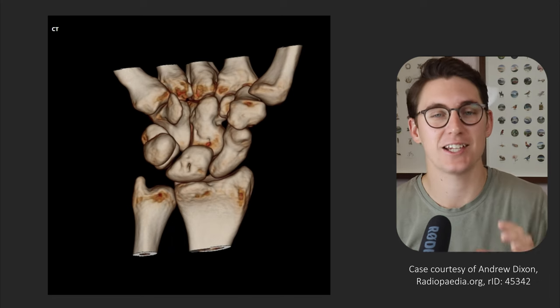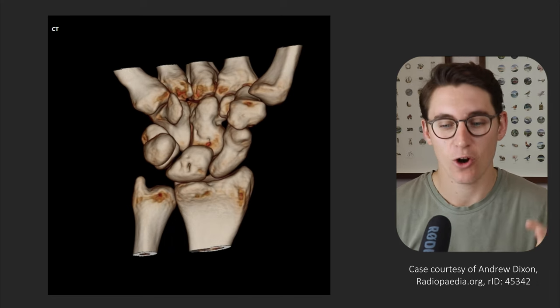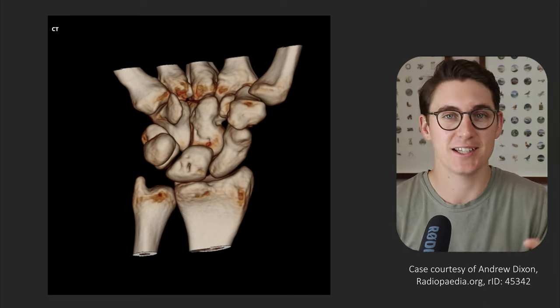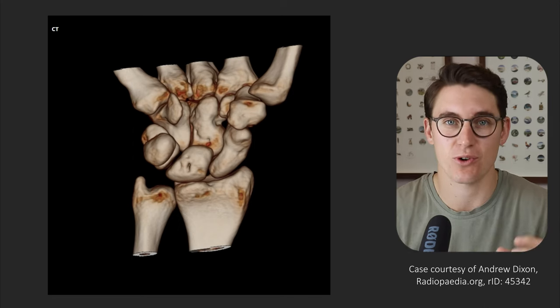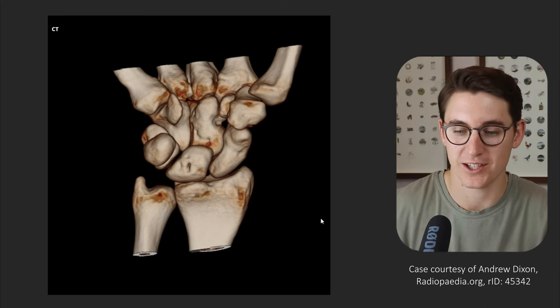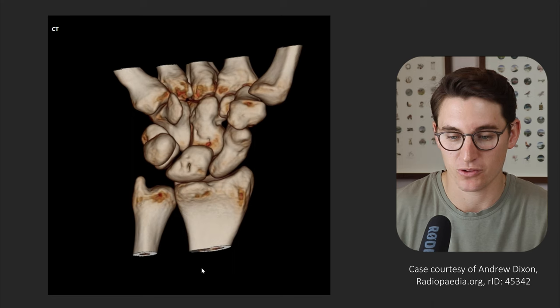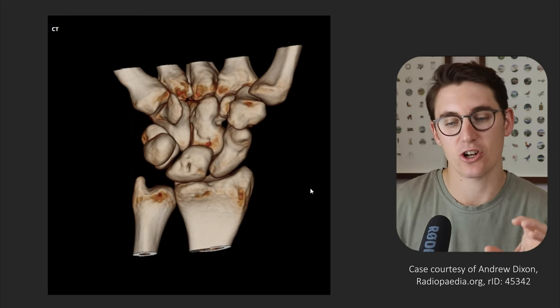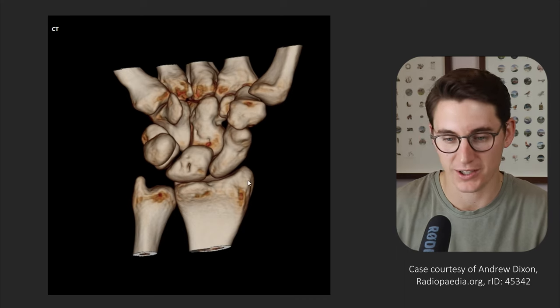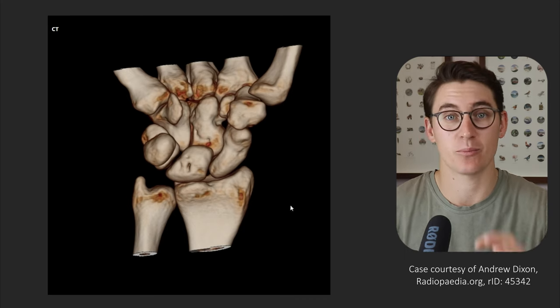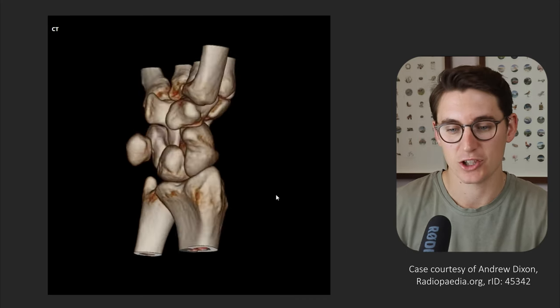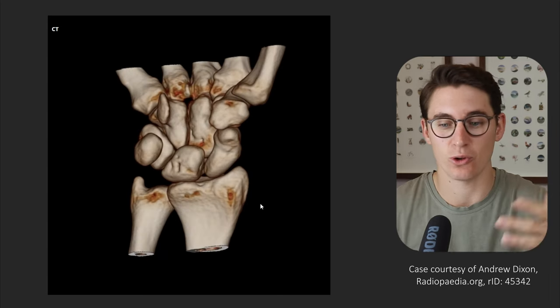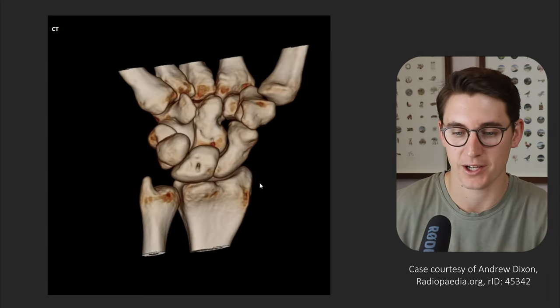For me, understanding wrist anatomy always comes back to understanding the bony anatomy — how the carpal bones interact with one another, as well as how they interact with the bones of the forearm and the metacarpals of the hand. Let's start by looking at this 3D volume rendered CT scan, and I'm going to keep coming back to this image so we can understand the 3D anatomy before looking at our axial, coronal and sagittal slices in the MRI.